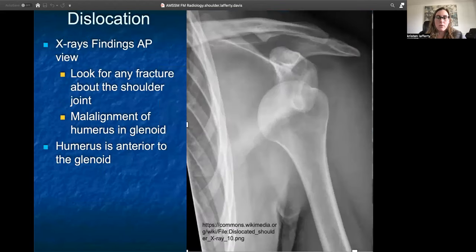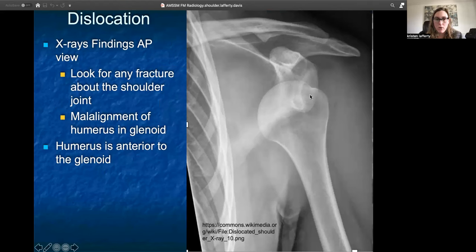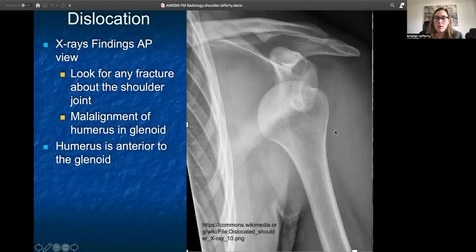Moving on to dislocations — here's an AP view showing an obvious anterior dislocation. The humerus is no longer within the glenoid. This is a good view to look for any possible fractures that might be a sequela of a dislocation episode, so make sure you take a good look at the back end of the humerus, as you can have something called a Hill-Sachs lesion there, and also look at the glenoid itself, since there are fractures associated with that called bony Bankart lesions.